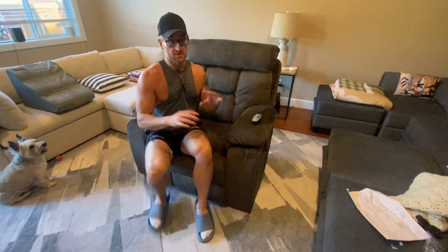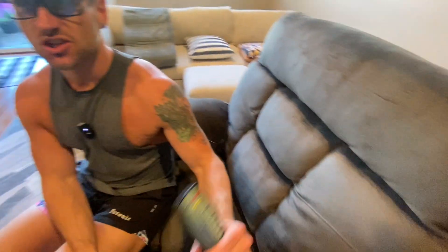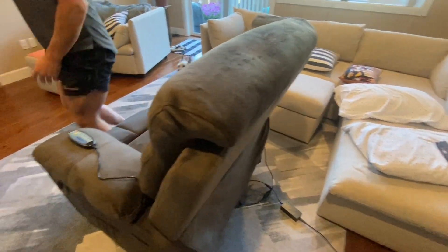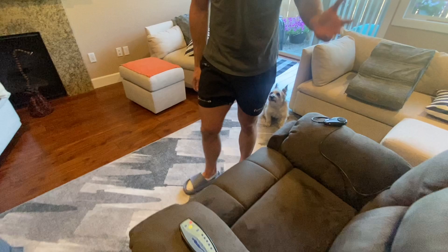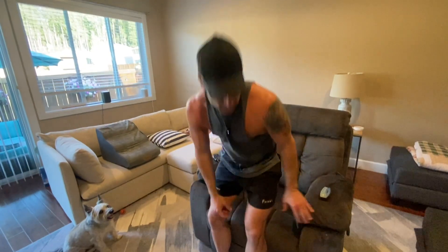Alright guys, I just built this for you — it's super easy to build. It's the Cobplins extra wide 26-inch massaging recliner. This holds up to 400 pounds, so if you're a little on the hefty side and you have mobility issues, this is probably the recliner for you.